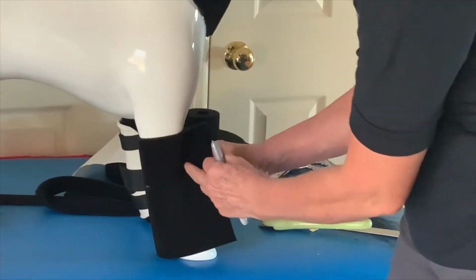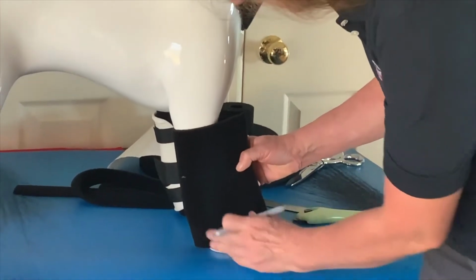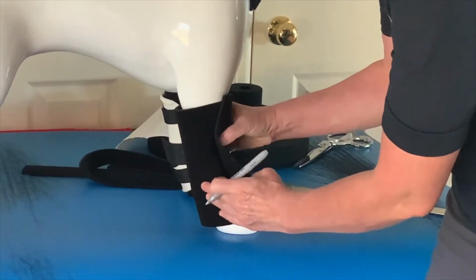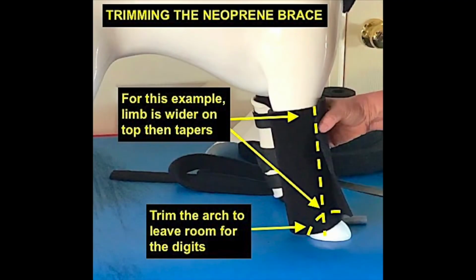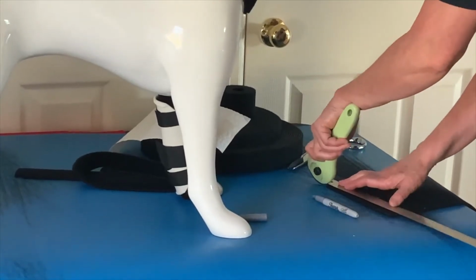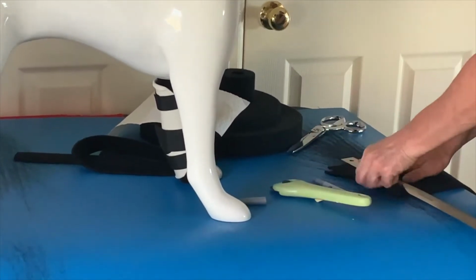Then check your neoprene sheet against the animal's limb. Use a silver pen or chalk to mark the areas that need to be trimmed. Usually the limb tapers at the bottom, so your brace should too. Also, don't forget to trim the arch over the digits. Keep trimming little by little and check your pattern frequently against the limb.